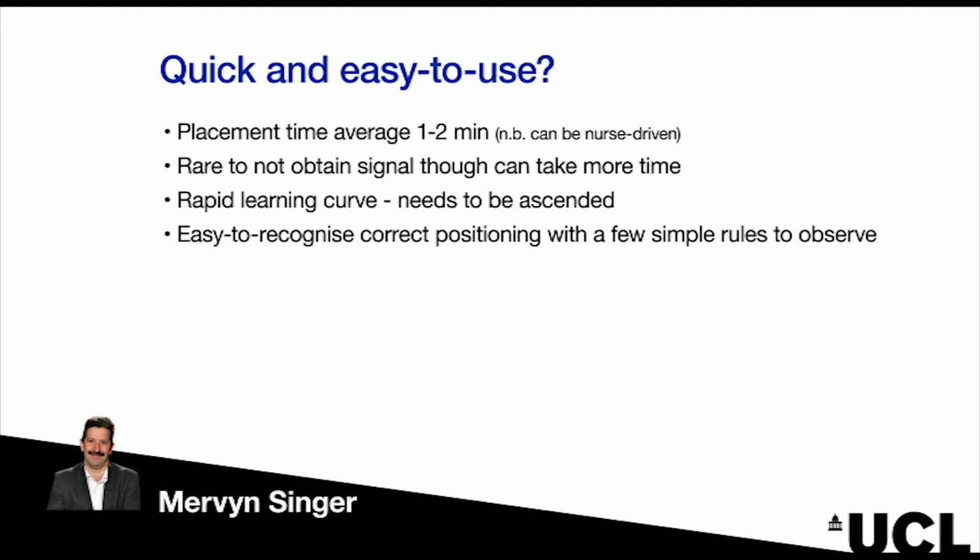So you're aiming for a nice crisp waveform with, the fancy term is narrow spectral dispersion. So you have the sort of colours on the outside of the waveform and with a black inside. So that means that you're looking at the centre of the aorta where the blood flow is laminar, so all of the blood essentially is going at the same velocity, and so the black represents no flow. If you're looking across the centre of the vessel, all the blood's travelling at the same speed. If you're looking at the edge of the vessel where friction slows down the blood flow velocity, you then see a much more filled in waveform. So nice, crisp, sharp looking waveforms with a black inside is representative of a well-focused Doppler probe.